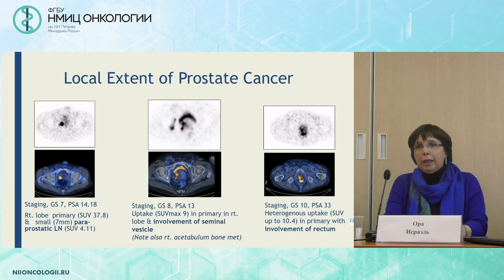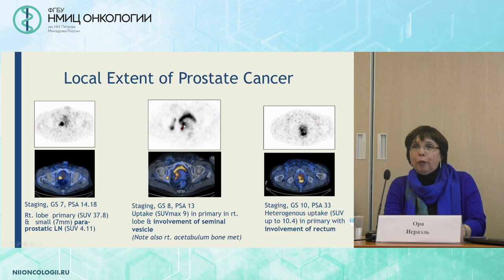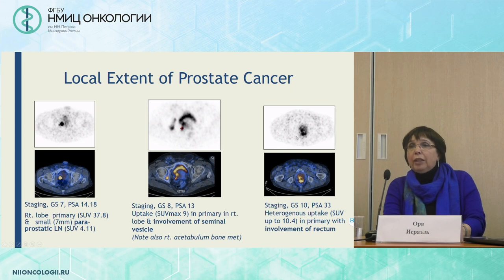MRI is the primary modality that should be used, but here we see uptake in the right lobe and also a very small — approximately 7 mm — paraprostatic lymph node. This is another patient with uptake in the primary tumor in the right lobe of the prostate, and we see that the tumor is involving the seminal vesicles. And this is another patient where the primary tumor is clearly seen involving the rectum.